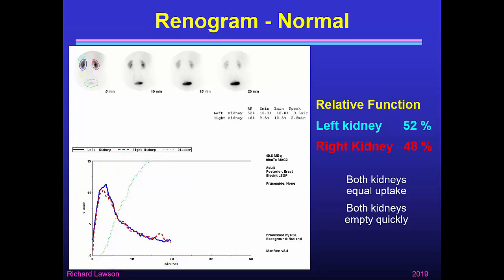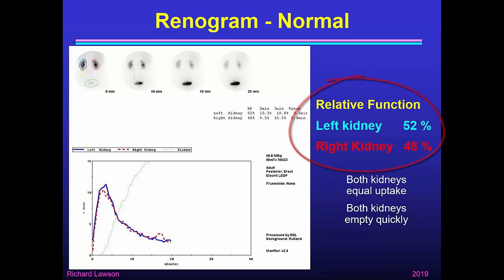We can see that during the first three minutes the left and right kidney curves rise equally quickly, showing that the uptake in each kidney is equally good. The computer calculates that the left kidney has 52% of the total function and the right 48%, showing that essentially both kidneys have equal uptake. After about four minutes the curves start coming down again, and both kidneys empty equally quickly. This display embodies all the information needed to interpret the Rhenogram, and this is the sort of display we're aiming to produce in this talk.